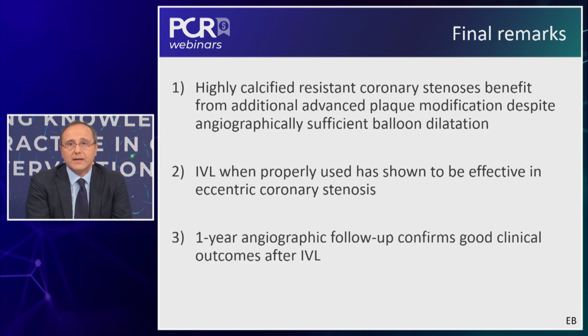And third, and last but not least, one-year angiographic follow-up confirms good clinical outcomes after intravascular lithotripsy. Actually, we've got the angio follow-up from Flavio. We've got the clinical follow-up from Disrupt CAD III. So I really think the technique is mature enough to be used in our daily clinical practice when applied in a proper way.